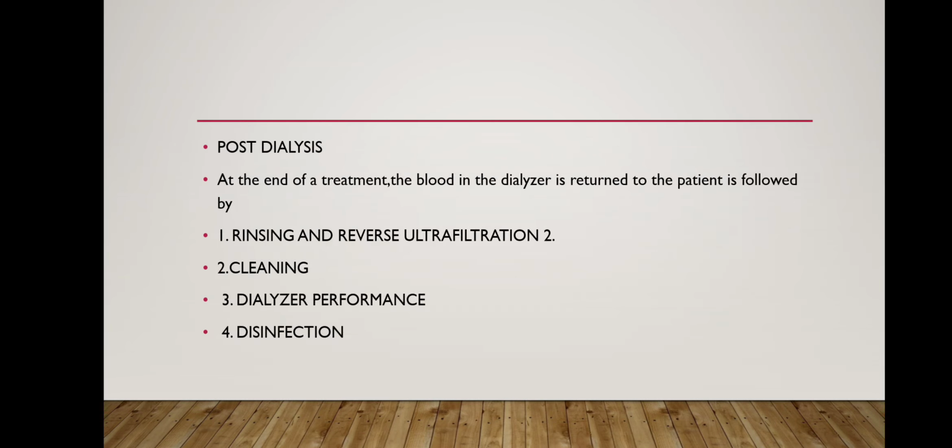Next, post dialysis. At the end of treatment, the blood in the dialyzer is returned to the patient, followed by first, rinsing and reverse ultrafiltration. Second is cleaning. Then the dialyzer performance check. Last step is disinfection. These are the important reprocessing steps of the dialyzer.